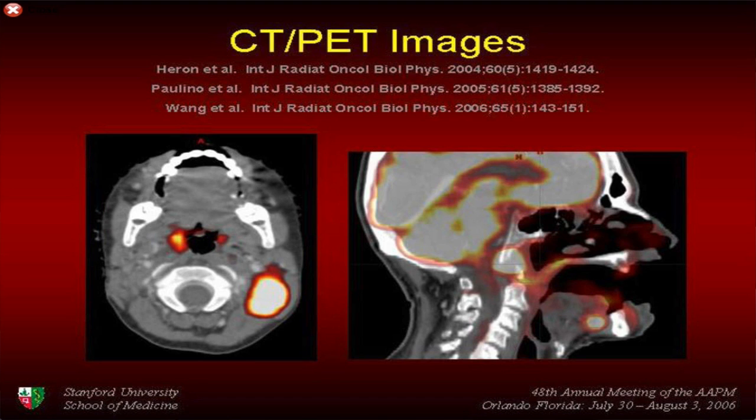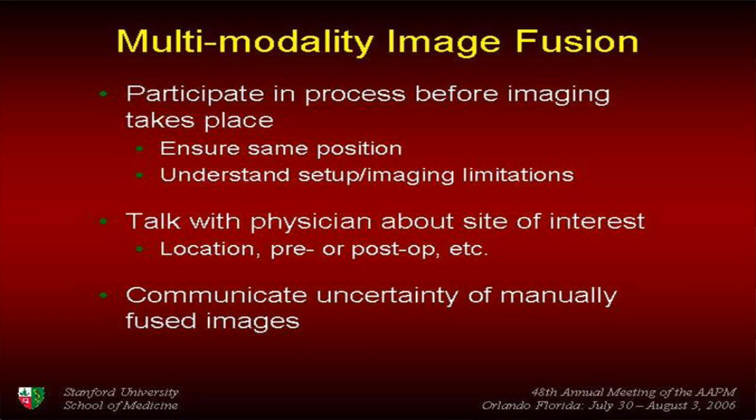Be careful about how they draw those targets based on PET images, based on whatever window and level is. There is no standard right now on exactly what constitutes tumor and what window and level you should put to draw that target volume.